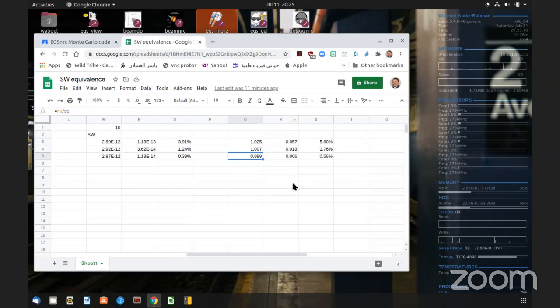Okay, clear? See, it was simple, and I wish someone would actually do this now for a 15 MV, for example. Do it for a different phantom, different material, PMMA, lucite, or polystyrene. Maybe we can do it, but this is the same concept. Investigate with different field sizes. So now I've done it for cobalt, but now let's do it for a small field, a large field. Is there a difference, or the same?